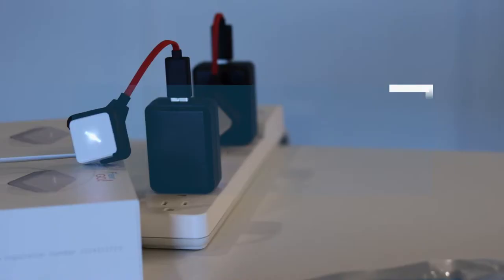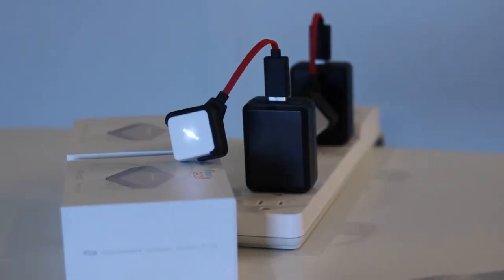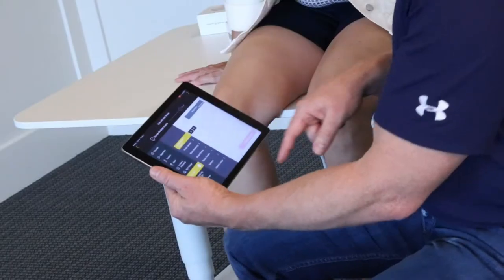It is a wireless surface EMG. In this session we're going to show how we can isolate a specific muscle — in this case we're going to pick the medial part of the quadriceps, which is the vastus medialis, and we're going to work on 60 seconds of muscle contraction using the Fluxer Go app.